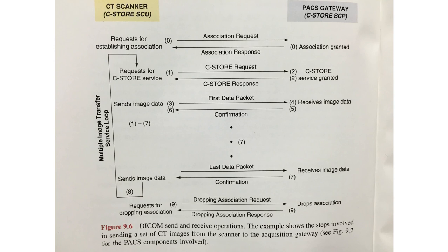That's how DICOM sends, and that's how chatty a DICOM connection is. That's why move is faster, because it uses 2 channels, and that's why it takes a long time to move images from one place to another, because of how complicated and complex this type of connection is.